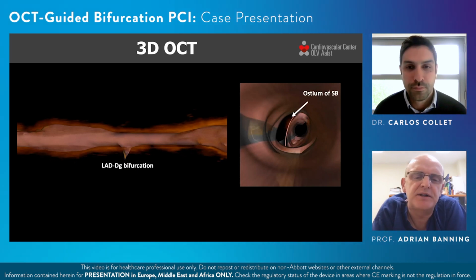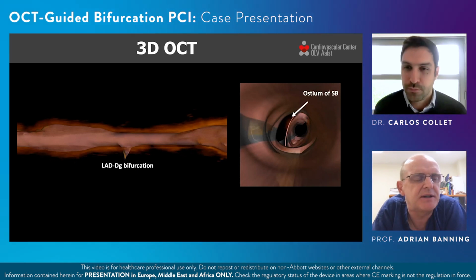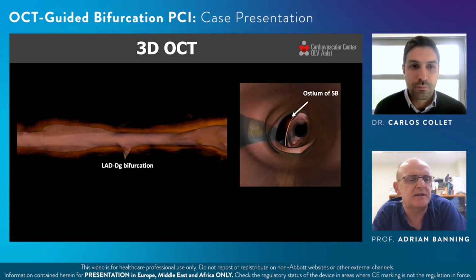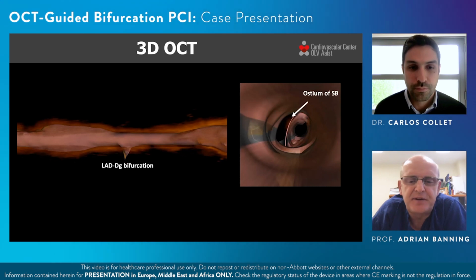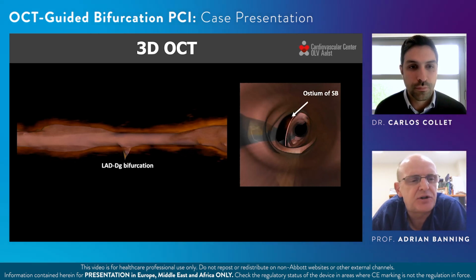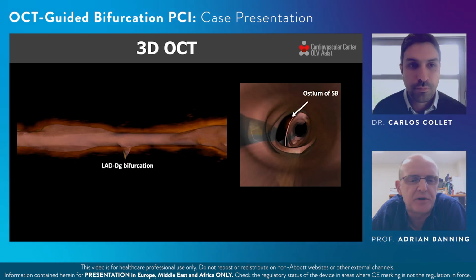Nicolas, drug-eluting balloon versus a second stent. Clearly, in this case, a third stent, because this is a bifurcation. We've all put 2 more stents inside 2 existing stents, but it can be difficult, particularly maintaining wire access to the branches. Which technique would you favor? Would you prefer to try and treat this with a drug-eluting balloon if at all possible?